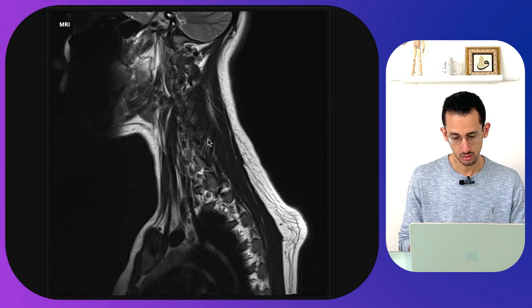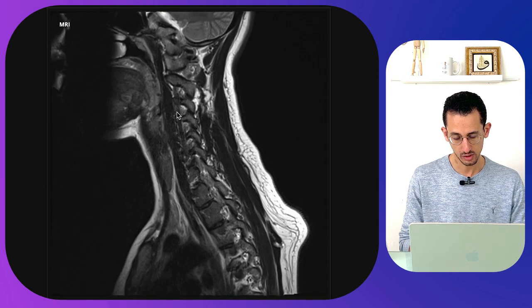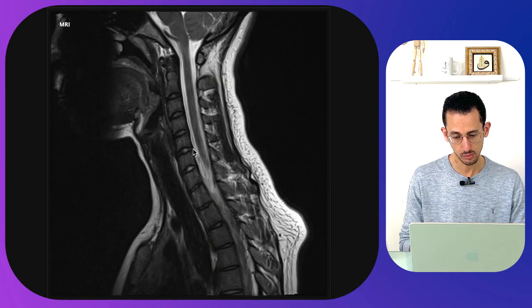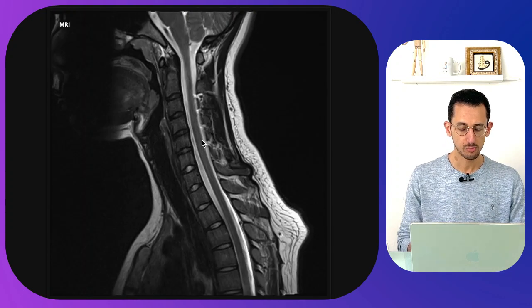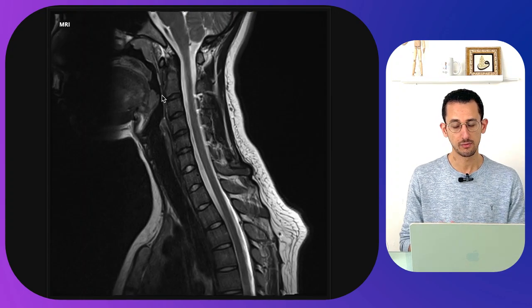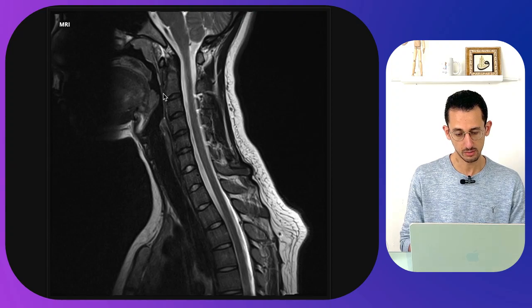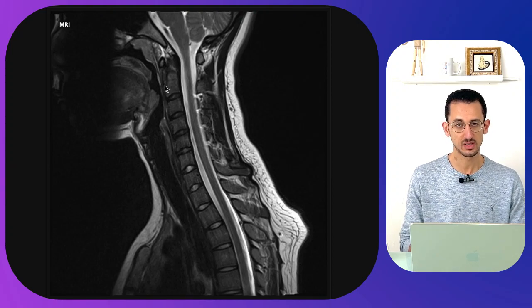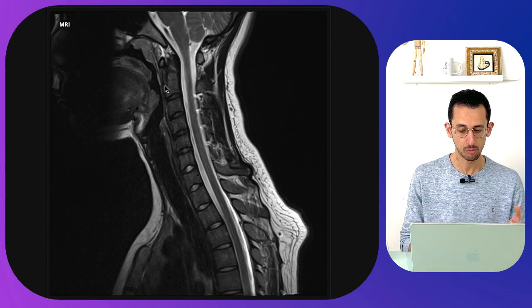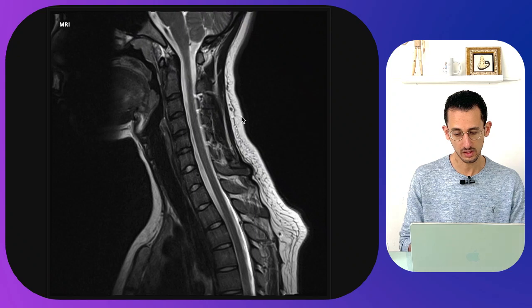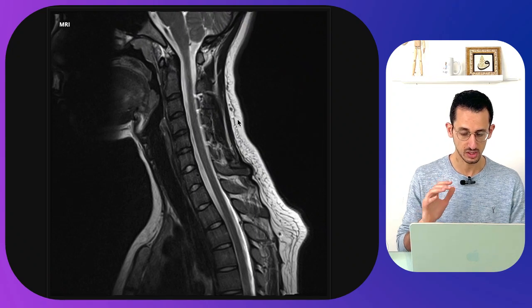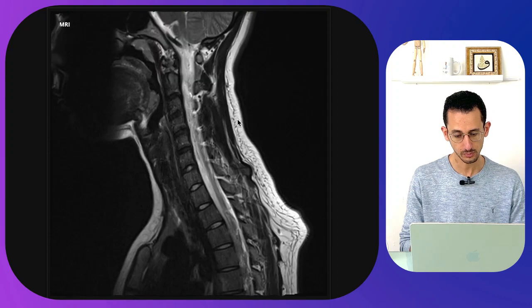Moving laterally you can identify the nerve roots within the foramen on both sides. It's also important to look at the pre-vertebral space to identify any pre-vertebral swelling that could indicate trauma. Moving more posteriorly, the white signal is the subcutaneous fat in this patient.